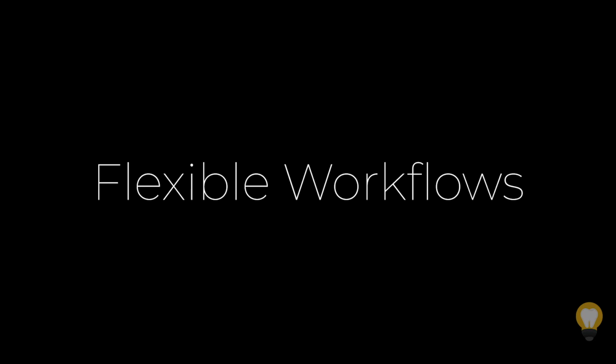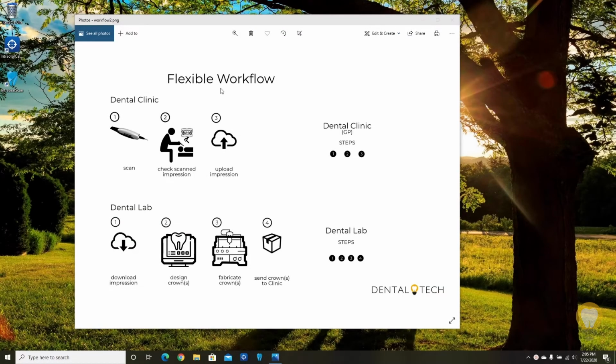Flexible workflows. Let's analyze a typical flexible workflow. It is flexible because steps are added or subtracted depending on the restoration type. This is a workflow for a general dental practice.